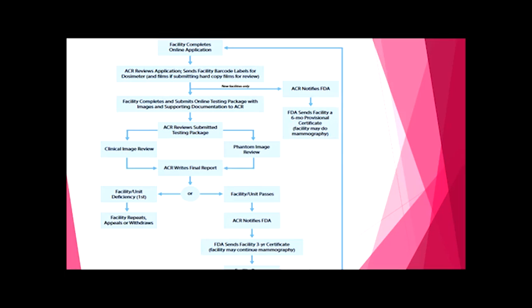But once you've been accredited and you're an established facility, then there are certain things that are going to occur. You're going to get inspected every year. There are things in place where you could have to participate in one of their random image reviews, and we'll talk briefly about that.